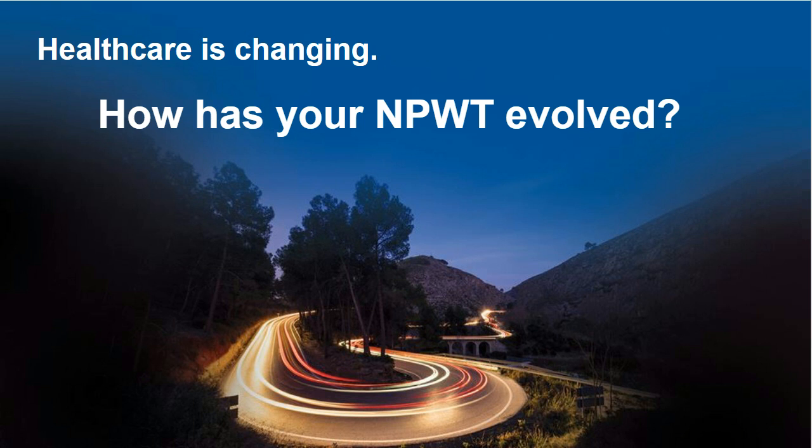Yes, thank you. As practitioners, we know that chronic wound fluid is one of the major reasons why wounds stay chronic. So if we can efficiently and more quickly remove the chronic wound fluid from a wound, it just makes sense that we're going to heal that wound faster. That chronic wound fluid, when it's sitting in a wound, has inflammatory mediators in it like cytokines and MMPs. It also has infiltrating leukocytes that prevent wound healing. Also, it's got a very high pH, and we know that wounds heal in a lower pH. So it just makes sense that if you're dynamically removing that chronic wound fluid as needed, and the pump can sense that and remove it far more quickly, you're going to be in a better healing environment for that wound.